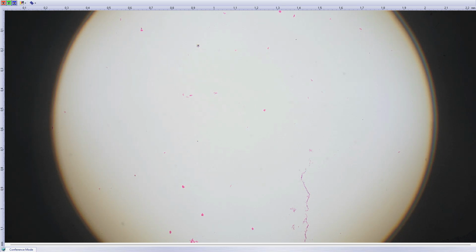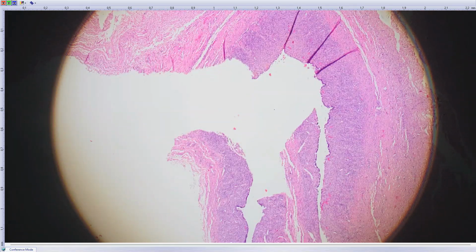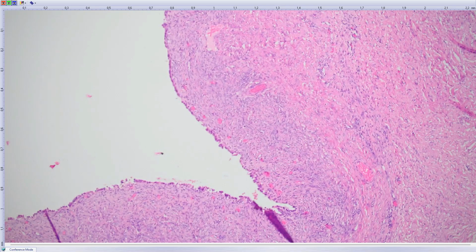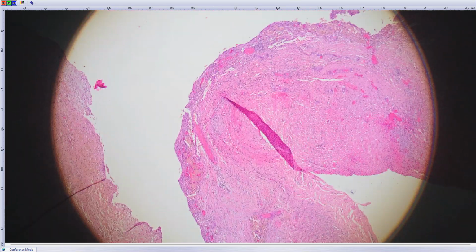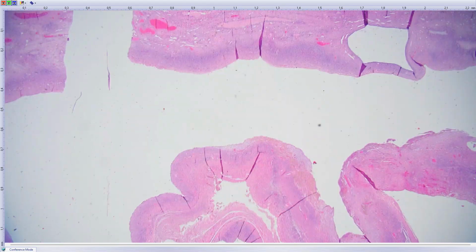The first case is a very fresh case from our department. It was a 44-year-old woman with adnexectomy. So this specimen comes from the ovary. And what you see here, I think it's pretty straightforward what it is. It's endometriosis, an endometrial cyst. I think most of us are very familiar with this. But there was not only endometriosis, but also other things in this biopsy. I have some circle, but I don't know where.